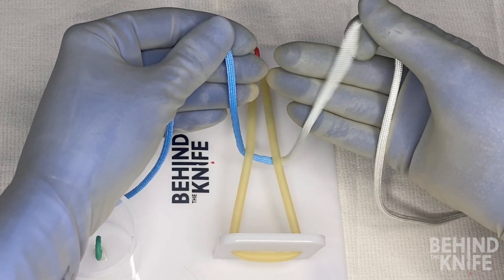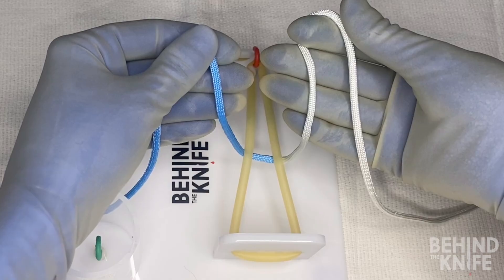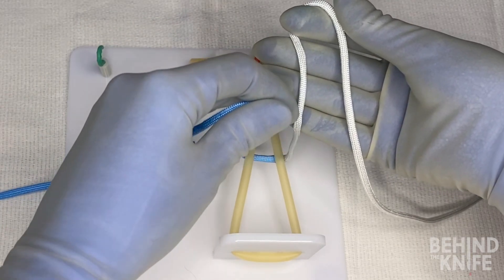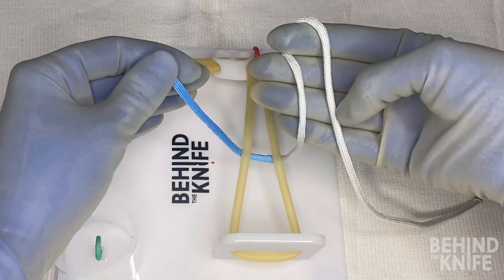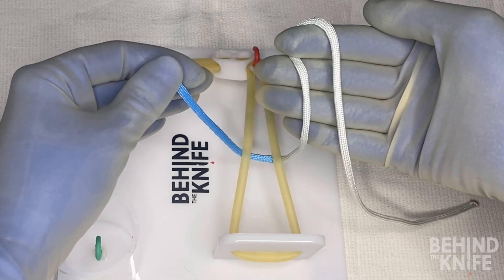To start, I'm going to drape the right side of my string around my right index finger so that the middle part of the string lays across these three fingers, drapes over my index finger, and then the loose end will come up and over my index finger and drape across the palm of my hand like this.